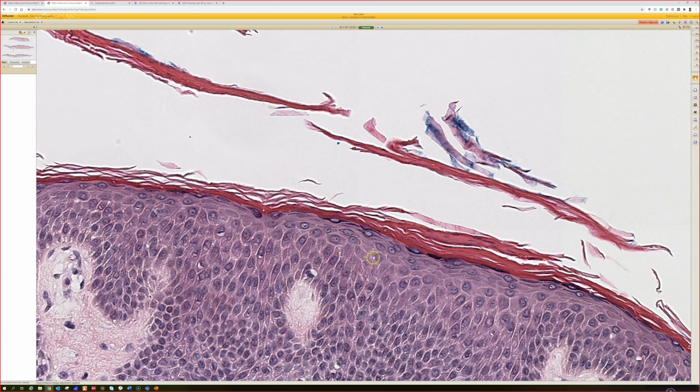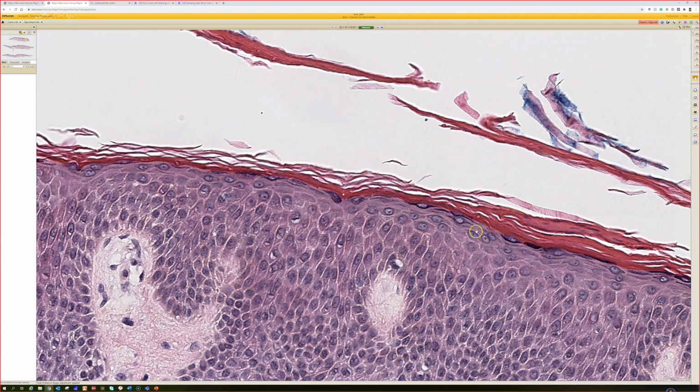Sometimes it's sandwiched between layers of parakeratin, like here, there's ortho and then dense ortho and then para. The sandwich sign is supposed to be pretty useful for dermatophytes or tinea. I feel like most often when I see the sandwich sign, it's not tinea. You can see that in resolving dermatoses where there was an inflammatory rash like spongiotic dermatitis, and then the patient comes for a biopsy 10 days later, and by that time it started to resolve, and so the layer of parakeratin has been pushed up by a layer of more normal keratin, all right? So here, the diagnosis is dermatophyte or tinea.